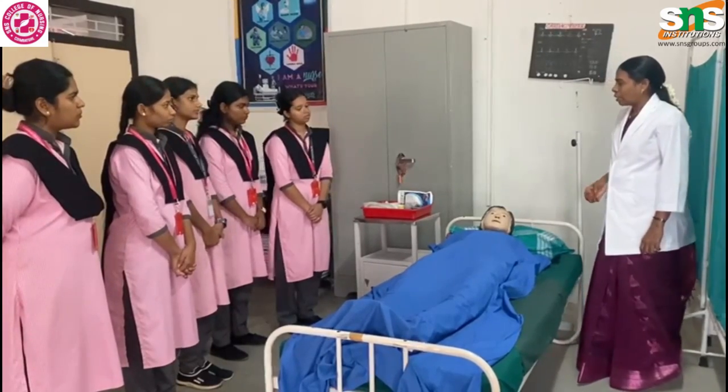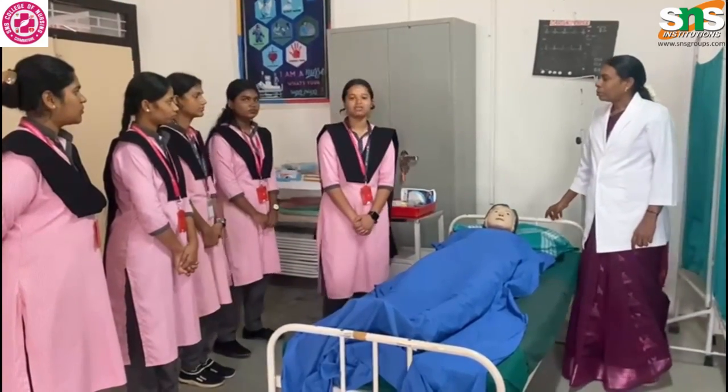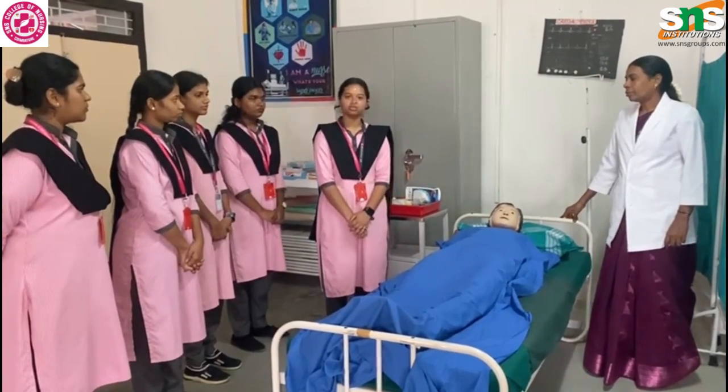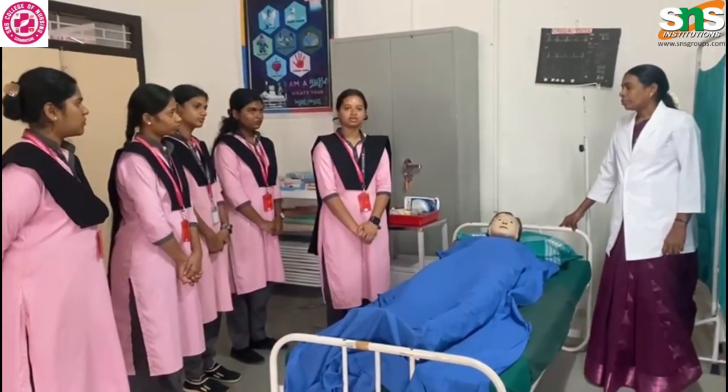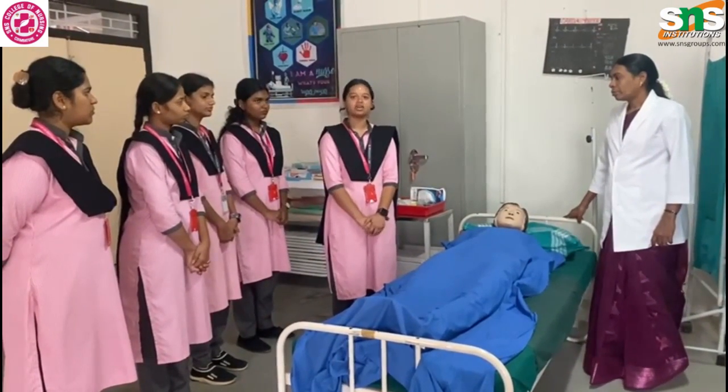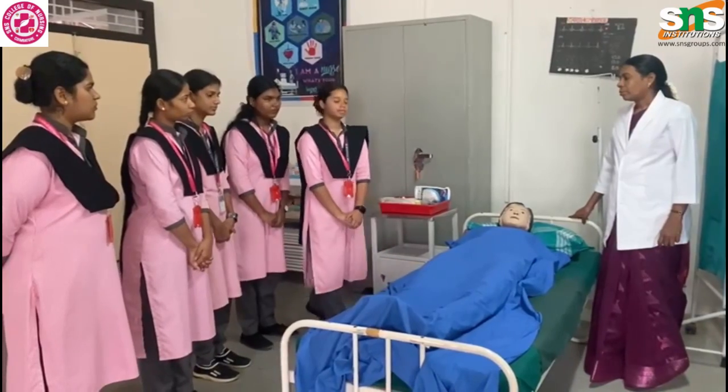Yes, you have to start. Hi all, my name is Adila from SNS Nursing. I am here to tell the definition of nasogastric tube. NG tube is defined as the administration of medication into the stomach through the nostrils for nutritional supplements.